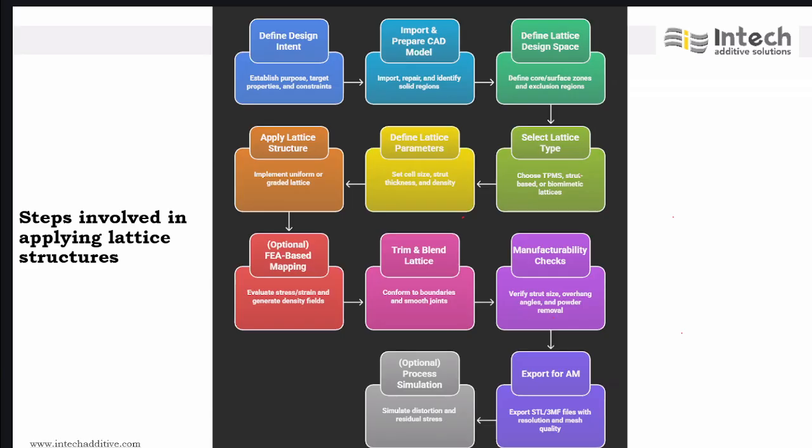Now there are so many steps. The next step is the process simulation. We are looking to simulate the part for distortion and residual stresses, so that it helps to predict warping or residual stresses, and sometimes it helps to validate the mechanical or the material properties.